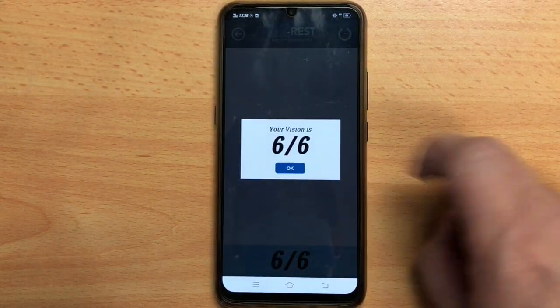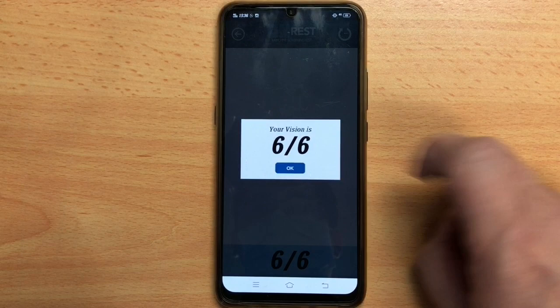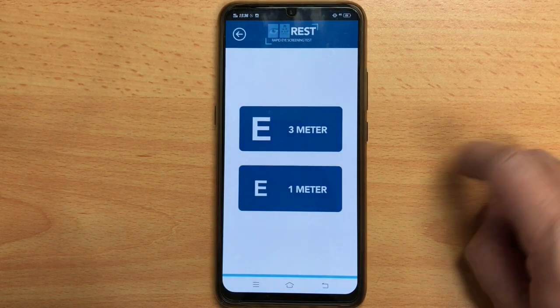At the end of the test, there will be a positive sound indicating that the test has completed and the patient has 6/6 vision. If your space is limited, you can use a 1m chart.